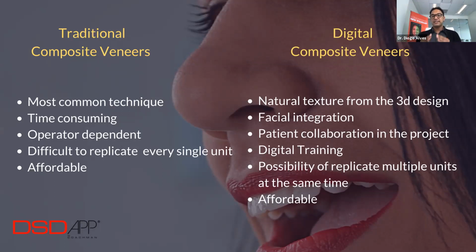One of the greatest things is that you can have the patient be a co-designer of their own smile. That engages the patient from the minute you start talking to them. Absolutely, that's a huge part of emotional dentistry, a huge key in it. That's my favorite part.